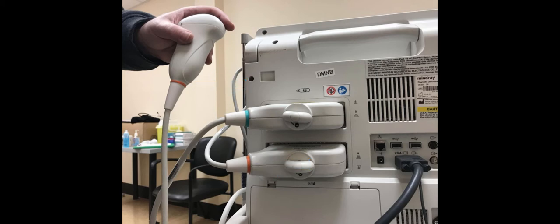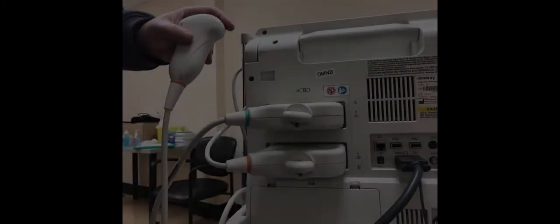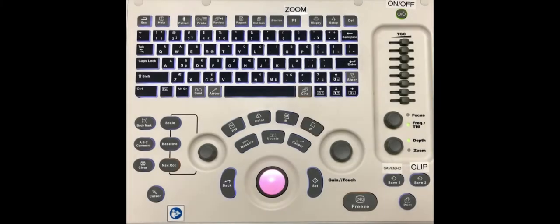If the incorrect transducer is plugged in, simply rotate the transducer connector knob anti-clockwise and remove the connector. Then, plug the correct connector into the socket and turn the knob clockwise. Next, on the keyboard, press the probe button. Use the trackball mouse on the keypad to select the correct transducer on the screen.